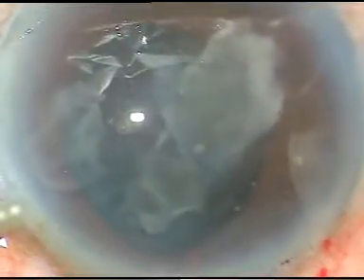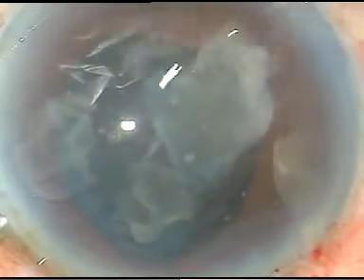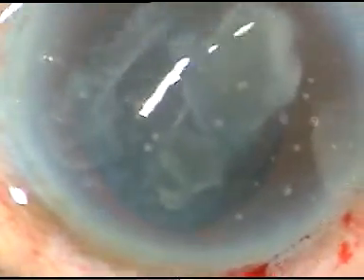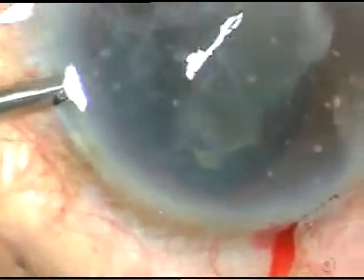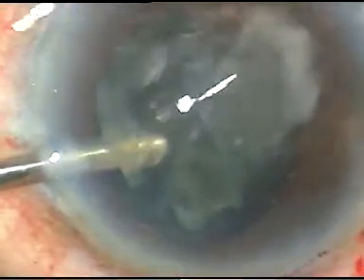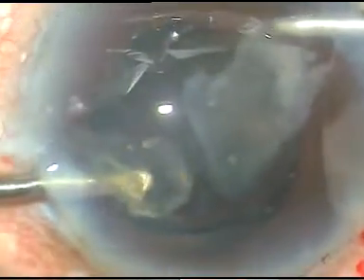Now here it is. The cutter is entering into the anterior chamber through the left side port, and the irrigation is through the right side port, and I am about to start removing this epinuclear material.